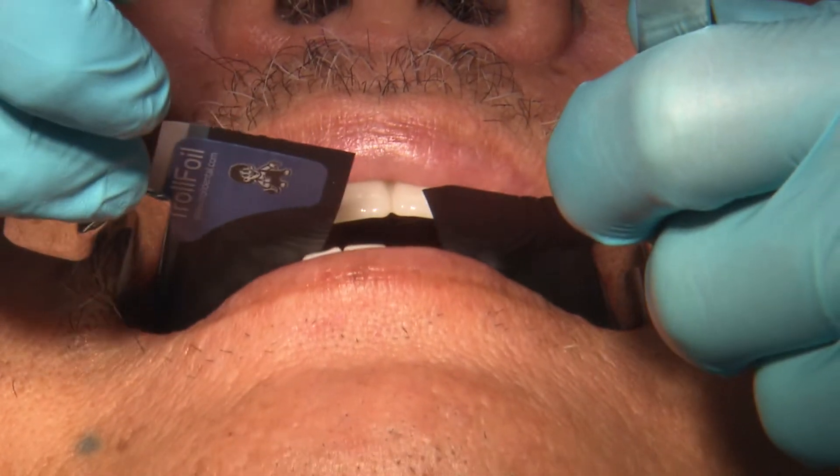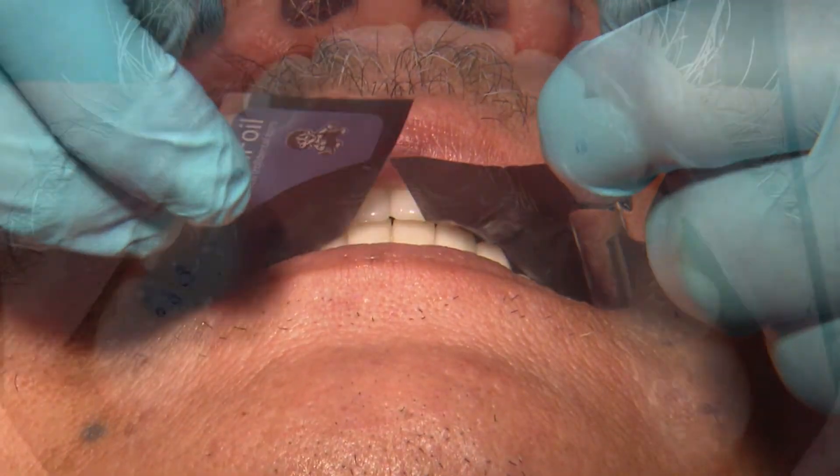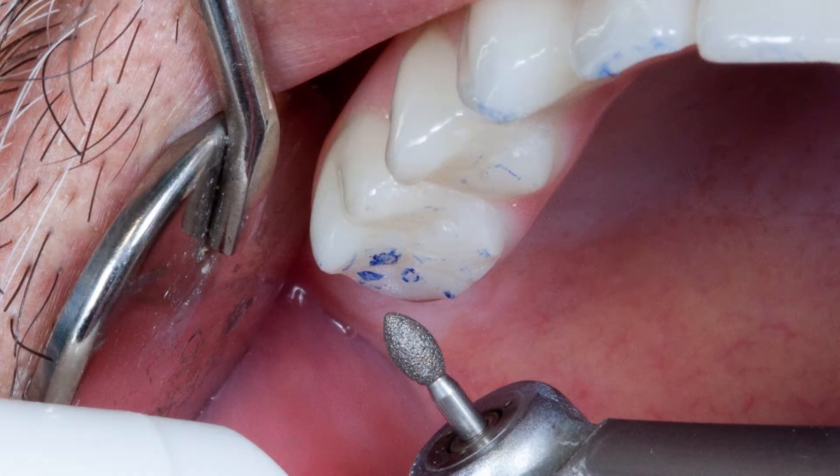Sit the patient upright and verify the vertical dimension as well as their occlusion. If occlusal adjustments are needed, a fine diamond burr can be used, followed by rubber polishing wheels.